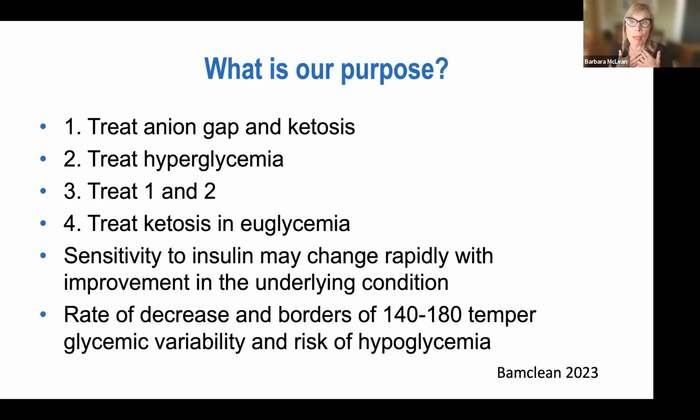So one of the biggest issues is for us to really understand that the Glucommander algorithm adjusts the insulin rate utilizing a multiplier that is continuously reevaluated by the patient's response to insulin, and it's incorporating the BMI and how much the glucose level has dropped over an hour's period of time or over a 30-minute period of time. And that multiplier is adjusted with a very intricate and complicated algorithm to the 5th decimal point. We're going to take a look at that in just a minute.